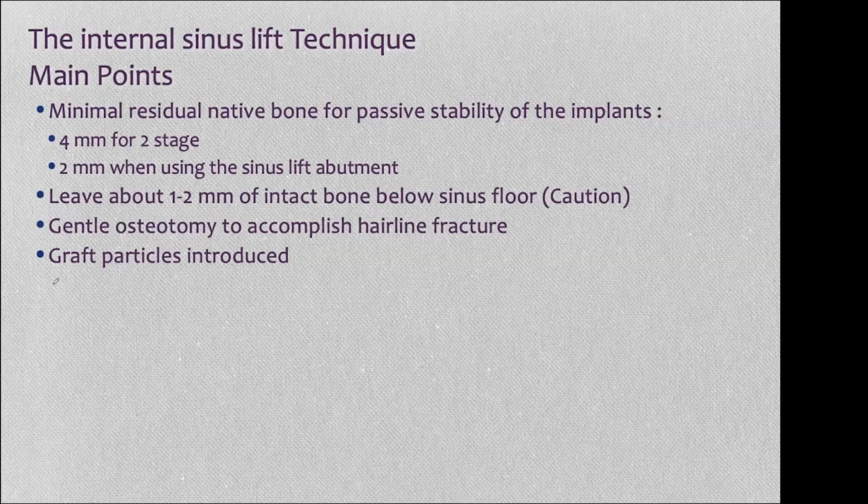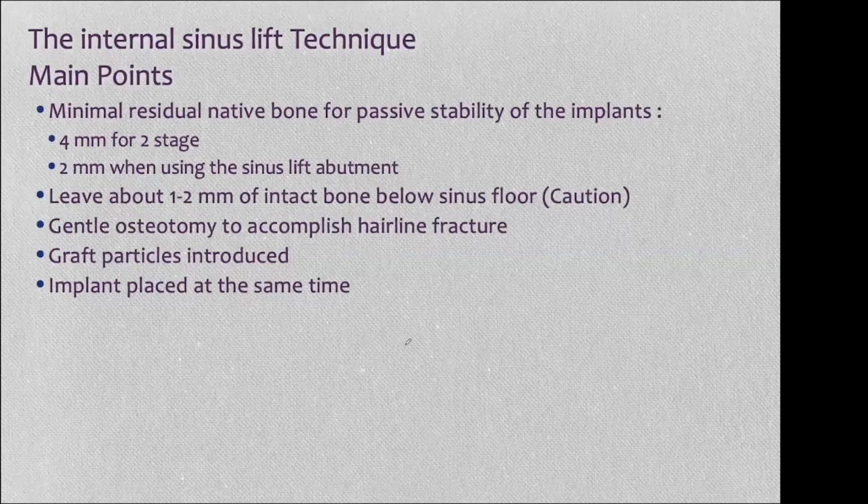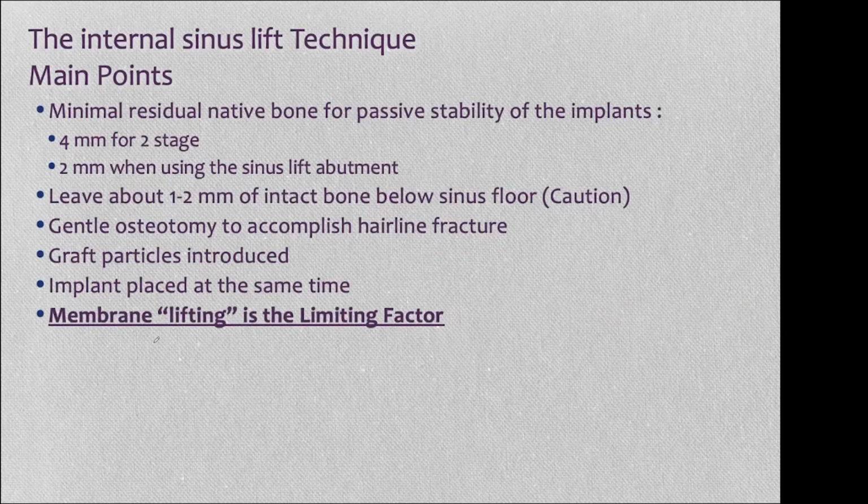And we repeat the process. And then at the end, when we introduce the implant, it will keep them where they have injected themselves. That's why the internal sinus lift using the SynthoGraft particles that are wet, okay, works so well with the Bicon ultra short implants. So again, my point about lifting the mucosal lining is revalidated because it is the limiting factor.